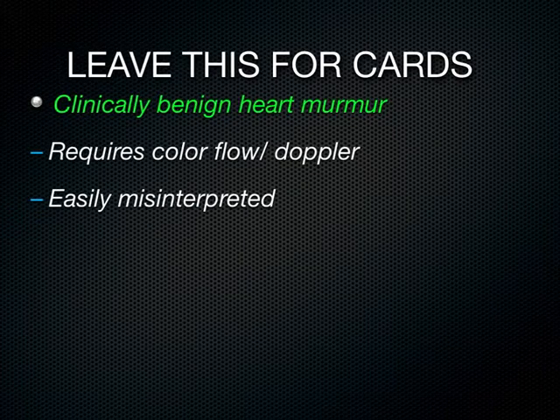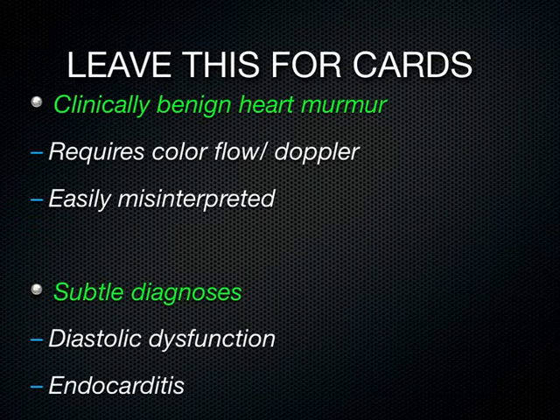But stuff we're going to leave to cardiologists, you know, stuff with the heart murmur. You come out of the room and go, hey, the patient's got a heart murmur, want to go look at it? Yeah, I'm sort of curious a little bit, as any doctor would be, to see what the murmur looks like. But really, to differentiate how much TR, MR, 1+, 2+, those things have no clinical bearing for me as an emergency physician, and it's easy to misinterpret those kinds of color flows across the valves. So other things like early diastolic dysfunction, endocarditis, I've hallucinated hundreds of times now. Just stay away from that stuff unless it's super obvious.